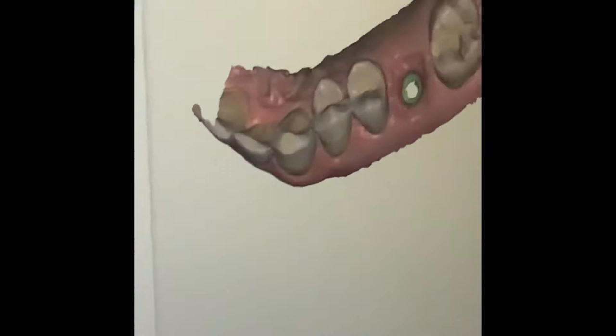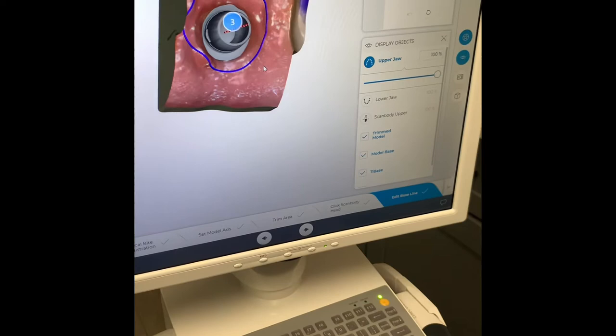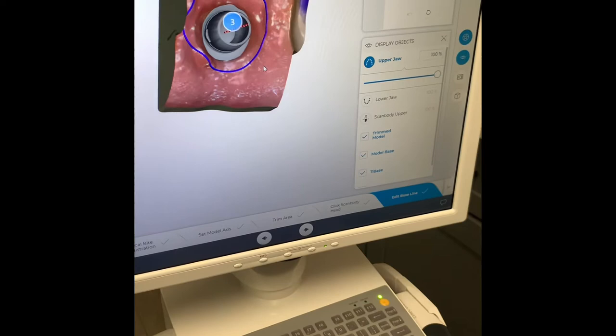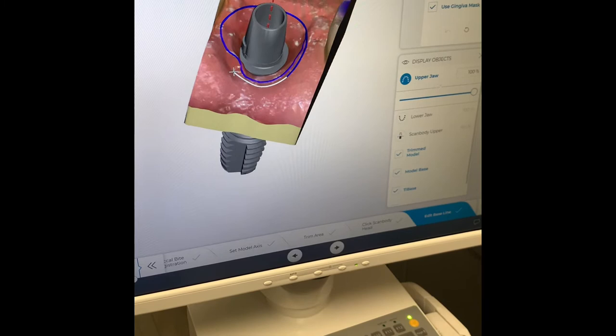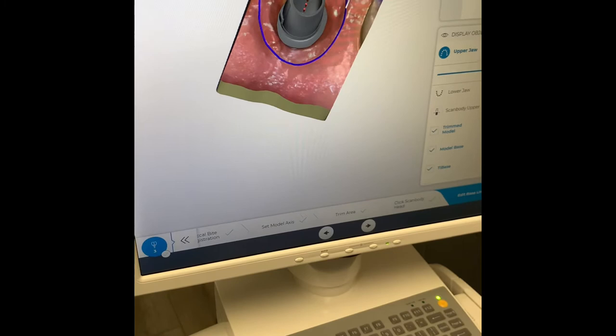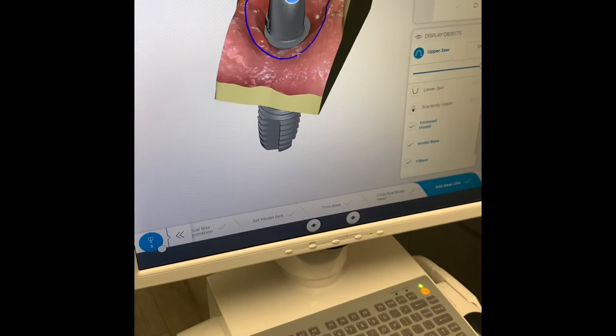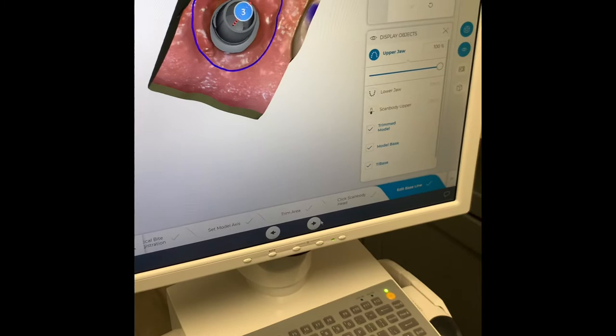Now we have the upper jaw, we have the scan body, we have a buccal bite, and we have the lower jaw. So this is the proposal you get back. I don't like to do it like this — I always like to use the gingival mask. So you click that button and now it'll use the gingiva that's there. I'm just going to outline where I want that emergence profile to be, which I think is going to be a little bit higher up. It'll kind of push that tissue down a little bit. All of our implant crowns do that, so that's normal.